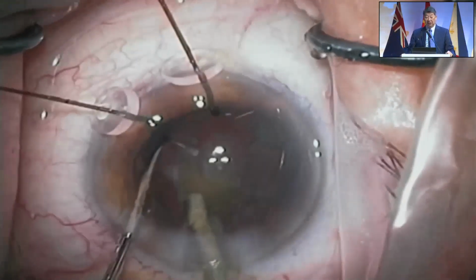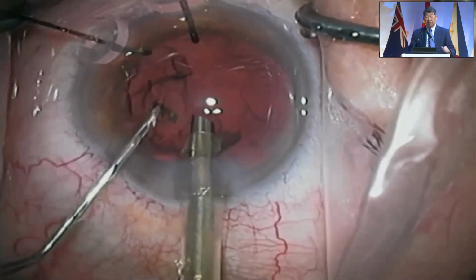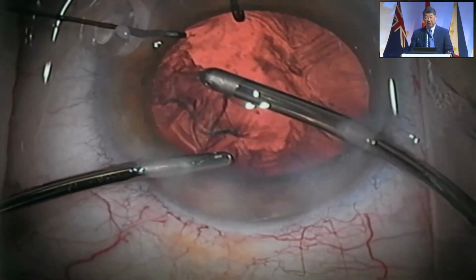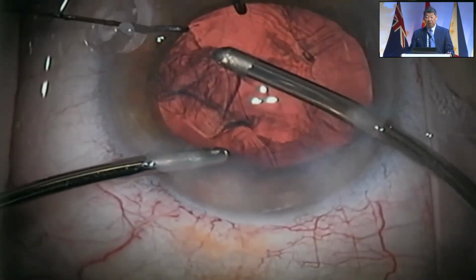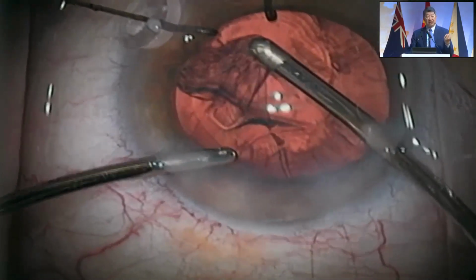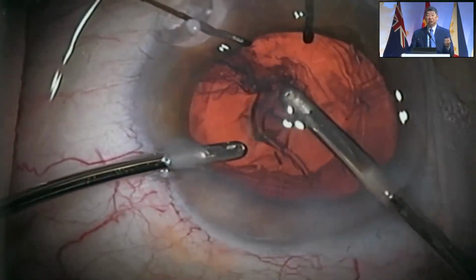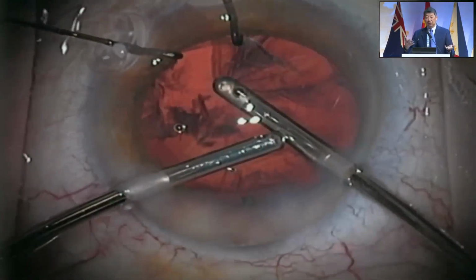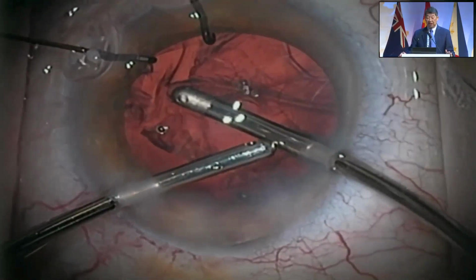And so here you can see how there's some viscoelastic to your left still. That's because it's a dispersive and it stays there. Now, I have the same problem. The posterior capsule is not anchored. It's not taut. So it doesn't want to separate easily from the cortex. I have to be so careful that I don't tear or aspirate the posterior capsule.